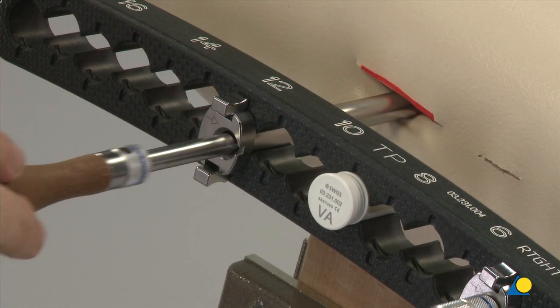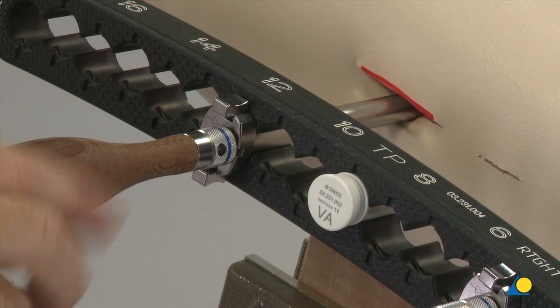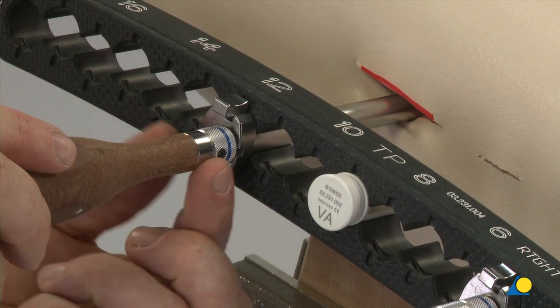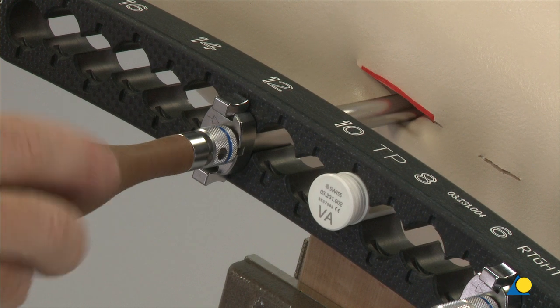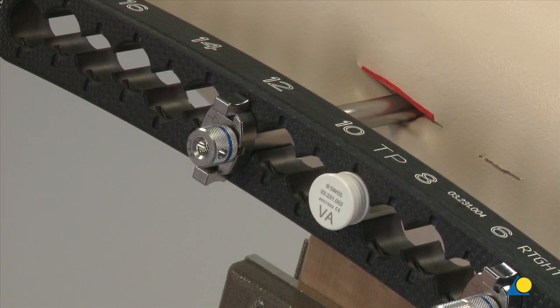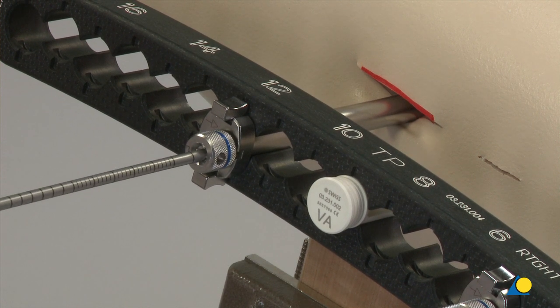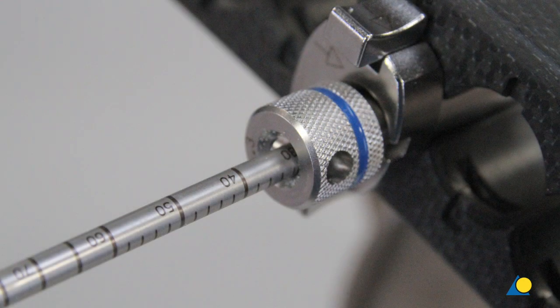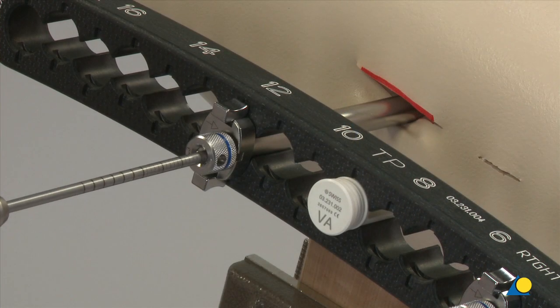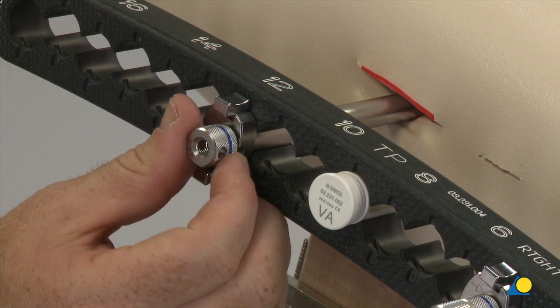Insert the 4.3 mm drill guide through the guide sleeve and thread it into the plate hole using the handle. Remove the handle. Prepare the screw hole with the 4.3 mm drill bit. Read the screw length off the calibrations on the drill bit. Remove the drill guide.